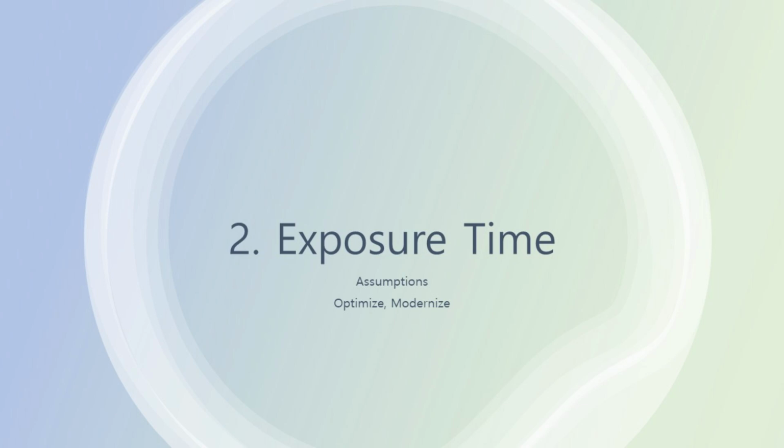Inadequate exposure may result in resin not curing fully, compromising the strength of the end product. Conversely, overly prolonged exposure can be counterproductive, leading to unnecessary energy consumption and potential distortions. Adapting the exposure time to suit the specifics of each project, as well as the resin type in use, is an essential step in the printing process. Often, this involves conducting several trials to pinpoint the most effective exposure settings.